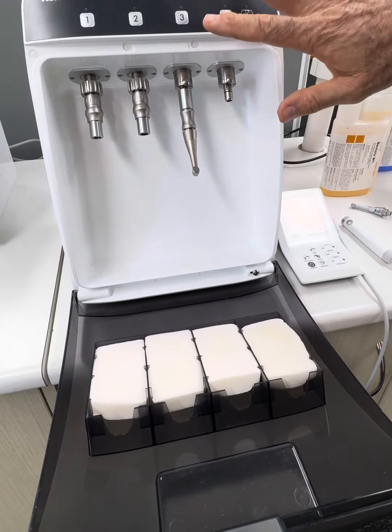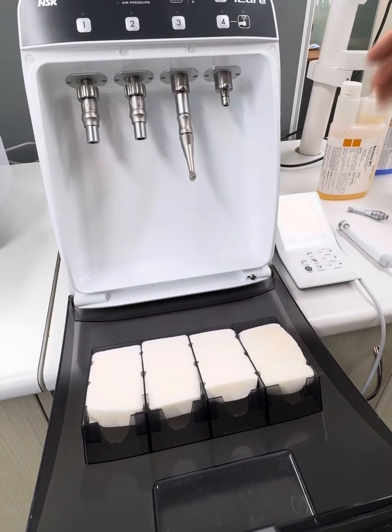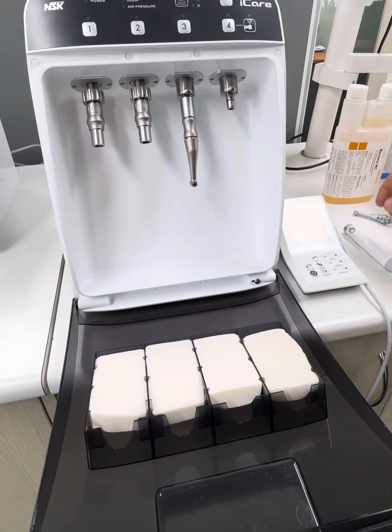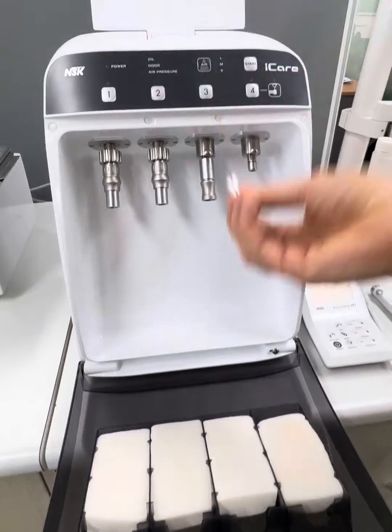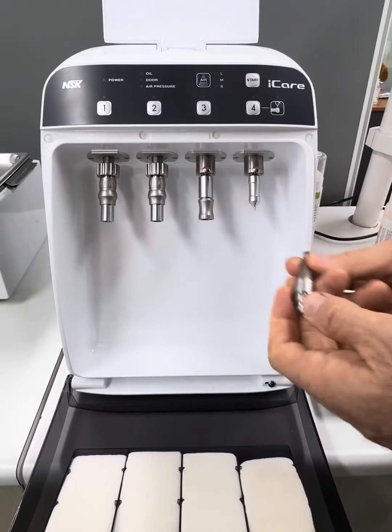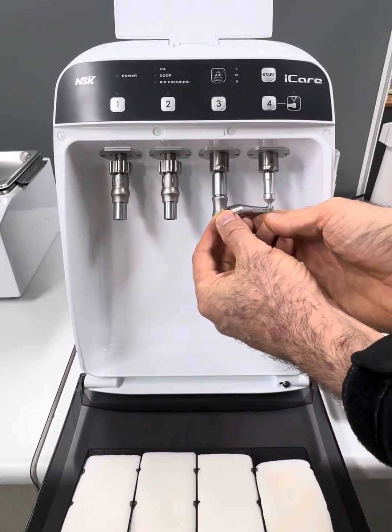And then we go through our normal lubricating process, which I'm not going to go through now because that will be detailed in other videos — but that's how we hook that one up. We've also got the option there for doing the chuck clean as well, which we should be doing on all of our handpieces at least once a week.